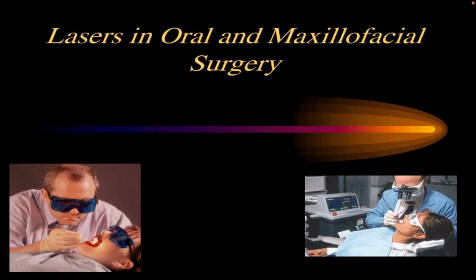Now, laser in oral and maxillofacial surgery, which is the main subject of this presentation. Lasers have rapidly become the standard of care for many procedures performed by oral and maxillofacial surgeons. The reason for this transition is due to the fact that many procedures can be executed more efficiently and with less morbidity using laser as compared to other scalpel instruments.